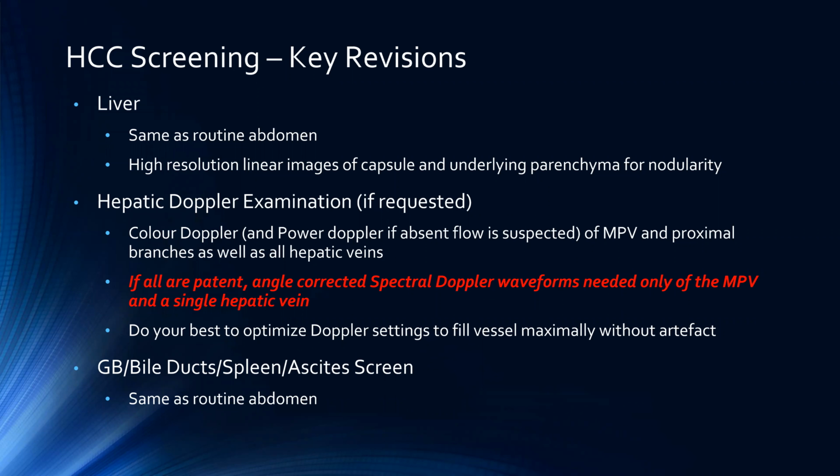Sorry, just to address Chantal's question with regards to the right lower quadrant and left lower quadrant examination for ascites. I think it should be routinely obtained on all abdomens. I don't have a good answer from a billing perspective if that would qualify as also a limited pelvis.